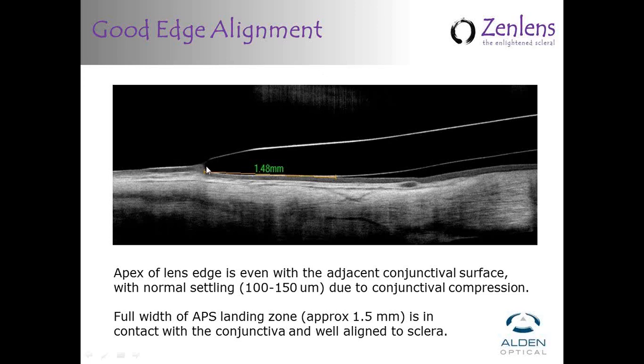It's typically not something to be concerned about. Perhaps I don't know if timing is even an issue, but I think usually this conjunctival tissue will bounce back, and that becomes much less obvious after maybe 15 or 20 minutes. I don't know, Dr. Jedlicka, do you have any? Is there any guideline when you're looking at that impression ring that's left, or is that something you pretty much ignore after lens removal?